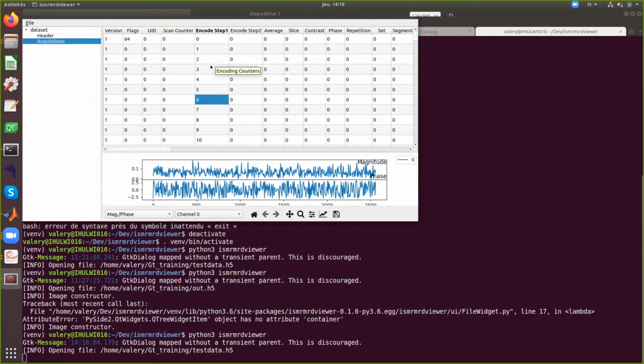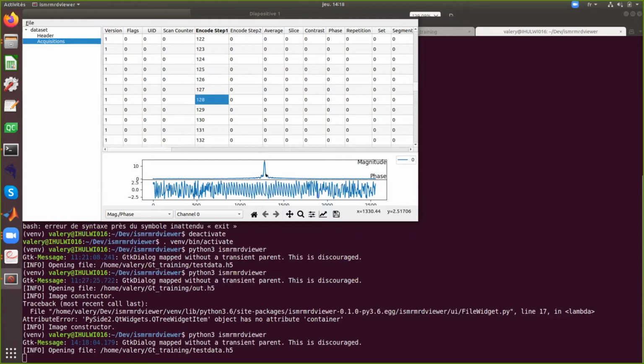And if we go to the 128, it should be nicer. Okay, you see your echo data.